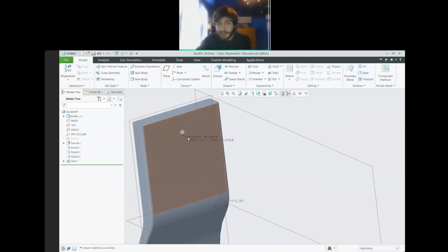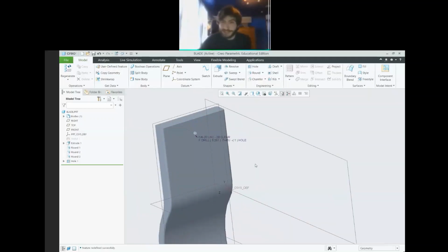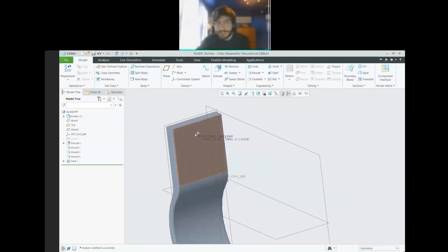And so we have our 1/4 inch diameter hole with 20 threads per inch. This 2B is indicating the precision and the direction of the threads. So B threads are internal threads, A threads are external threads. These are important things for when you go ahead and make the drawing and send it to a machine shop, so that the person who makes it knows what's going on. Any questions on holes? I will let anyone catch up because I know that was a lot of information I threw at you. Everyone has this hole.